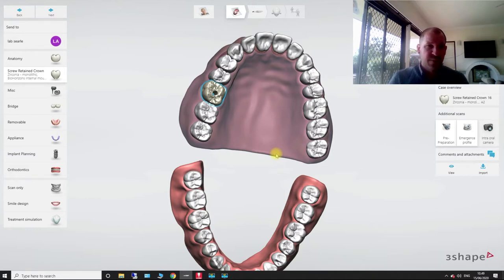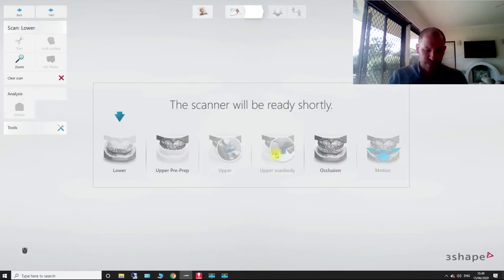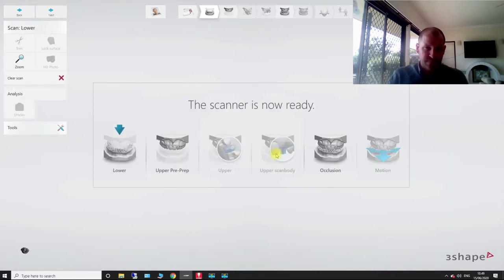So what I like to do is I like to do the scan with the healing abutment still in there. So now what we're going to do, do our usual, I'm just going to scan a quadrant on this case.